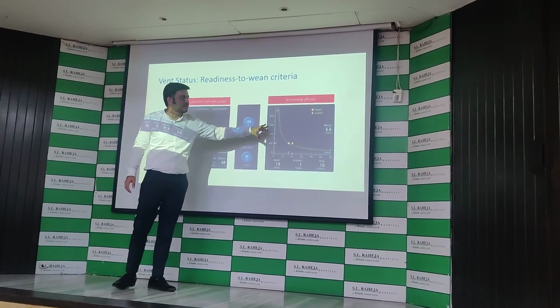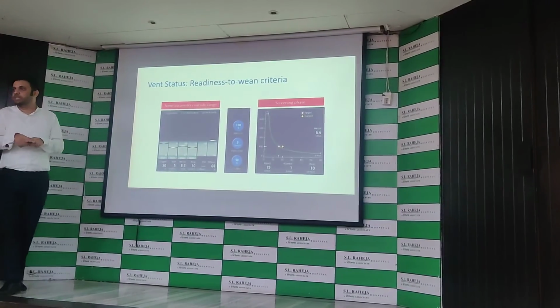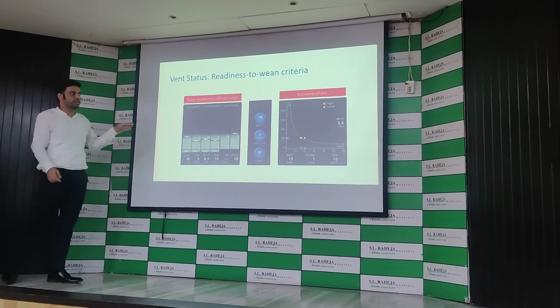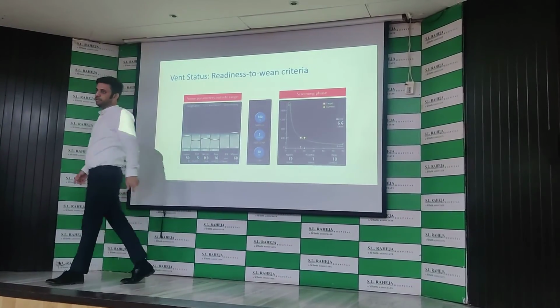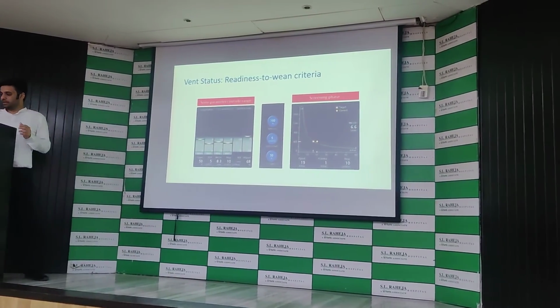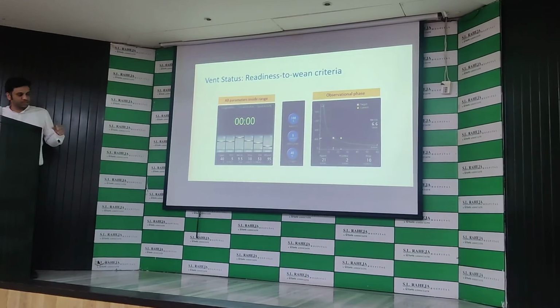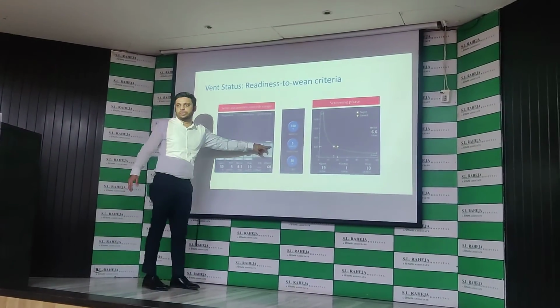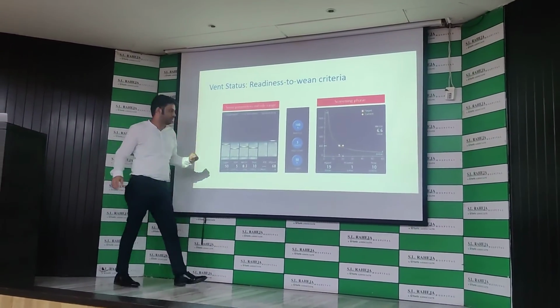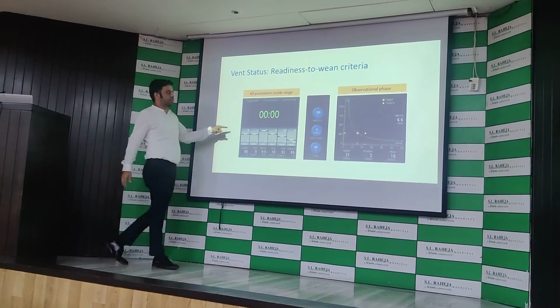Moreover, you can see the screening phase in the ASV graph. Again, I'm checking for the safety box. If you see here that this plus sign is almost near the target range, that means the patient is available to wean. In the back picture, it was outside the range. Now, in the next picture, it is inside the range. All the bars are inside the range.